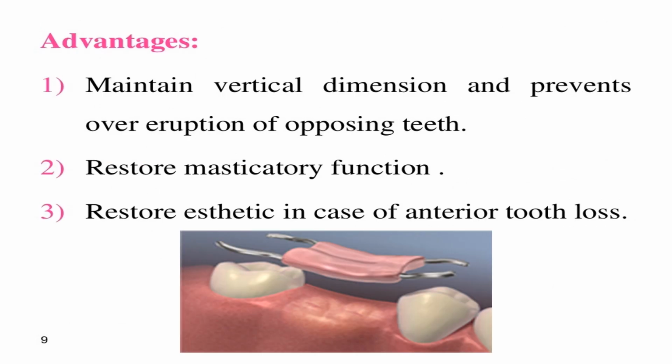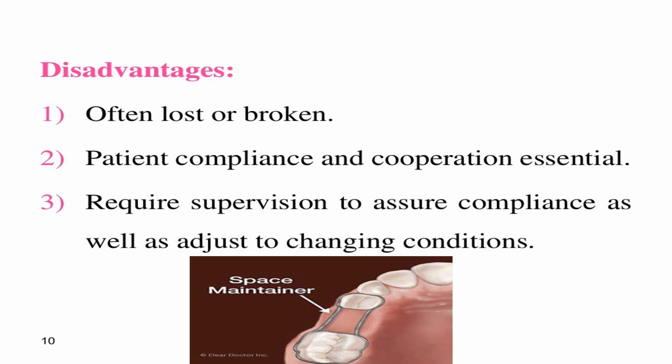Advantages: 1. Maintain vertical dimension and prevents over-eruption of opposing teeth. 2. Restore masticatory function. 3. Restore aesthetics in case of anterior tooth loss. Disadvantages: 1. Often lost or broken. 2. Patient compliance and cooperation essential. 3. Requires supervision to assure compliance as well as adjust to changing conditions.